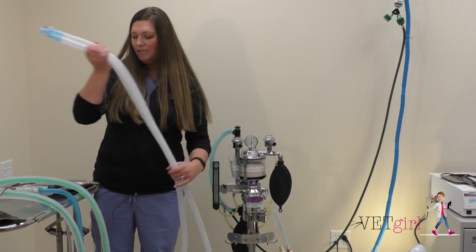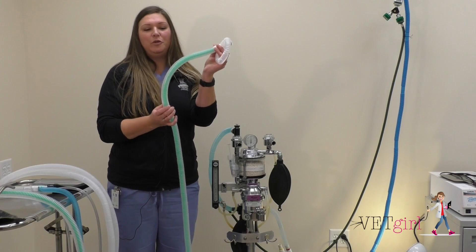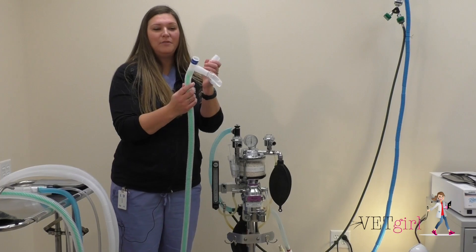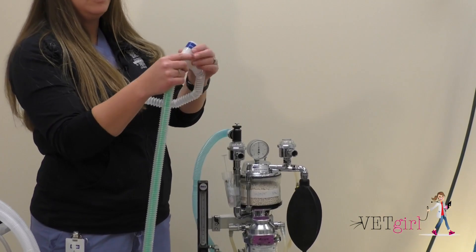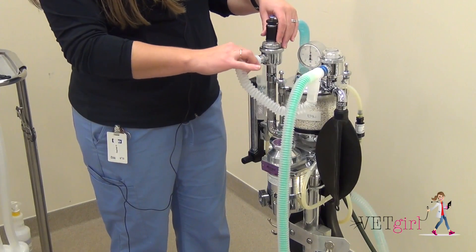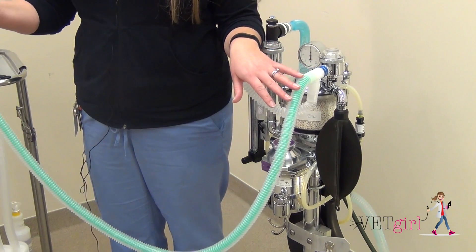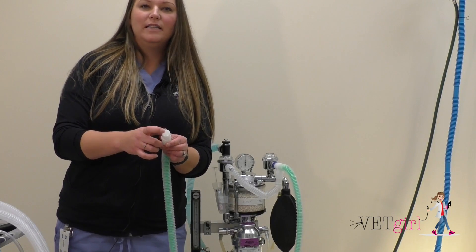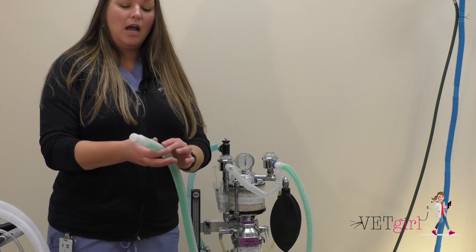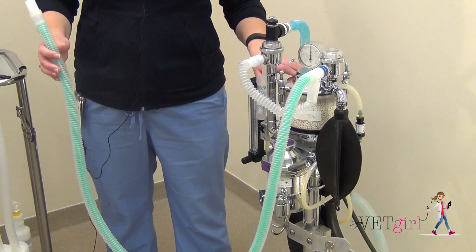The second re-breathing system we're going to talk about today is the F circuit. The F circuit looks a little bit different — it looks like one tube, but if you look closely, there are actually two tubes: a single small tube inside of a larger corrugated tube. In this case, it is important which valve you're hooking up to. Our inspiratory valve connection is the tubing that comes off the main stem hooked up to your patient — hook that up to your inspiration valve, and hook the other side up to your exhalation valve. With this system, fresh gas flows down the center tube all the way to your patient and exits on the inside. When the patient exhales, waste anesthetic gas flows outside of the center tube along the corrugated tubing, which returns to the exhalation valve, into the sodalime, and is recycled.